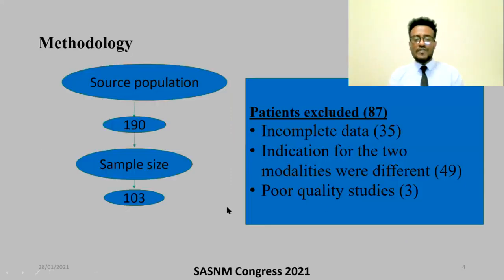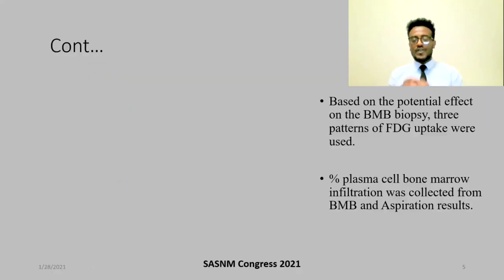Therefore, we performed a cross-sectional retrospective study. From a total of 190 patients with multiple myeloma, we recruited 103 patients based on our inclusion criteria, and 87 patients were excluded based on our exclusion criteria.